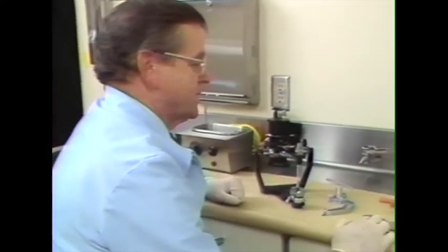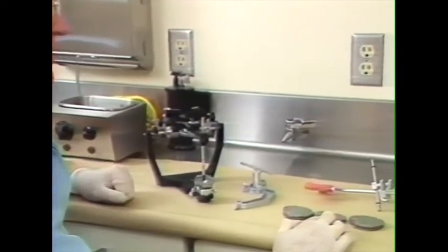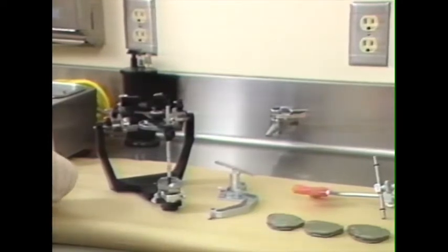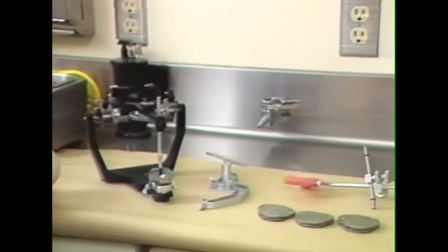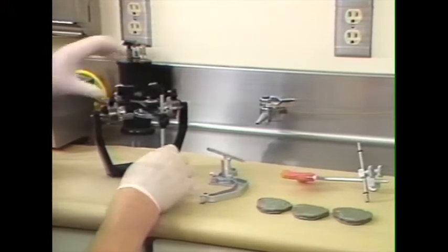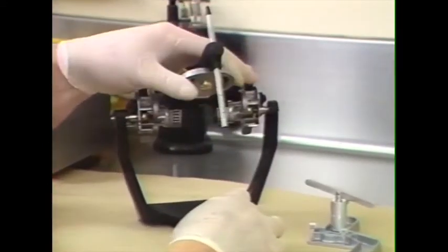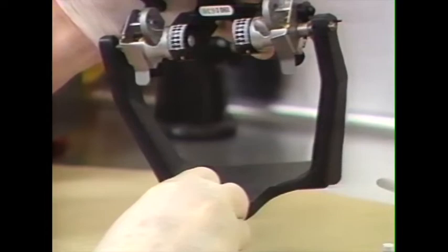Before dismissing our patient, we secured a centric relation record, a left lateral positional record, and a right lateral positional record, in addition to our face bow record. These can be transferred to the laboratory, or if the dentist is mounting his own casts, they are now prepared for mounting. We're going to mount the cast in the Hanau Model 190 Modular Articulator with, in this case, adjustable Bennett Fossey.